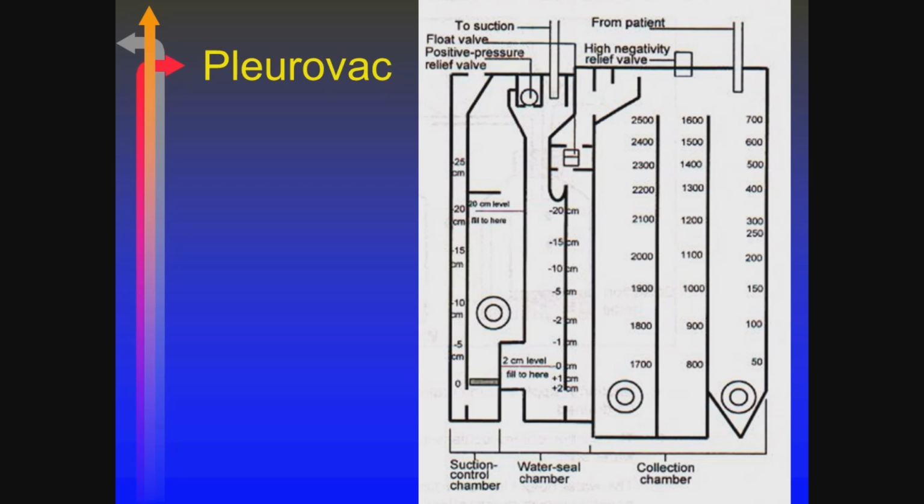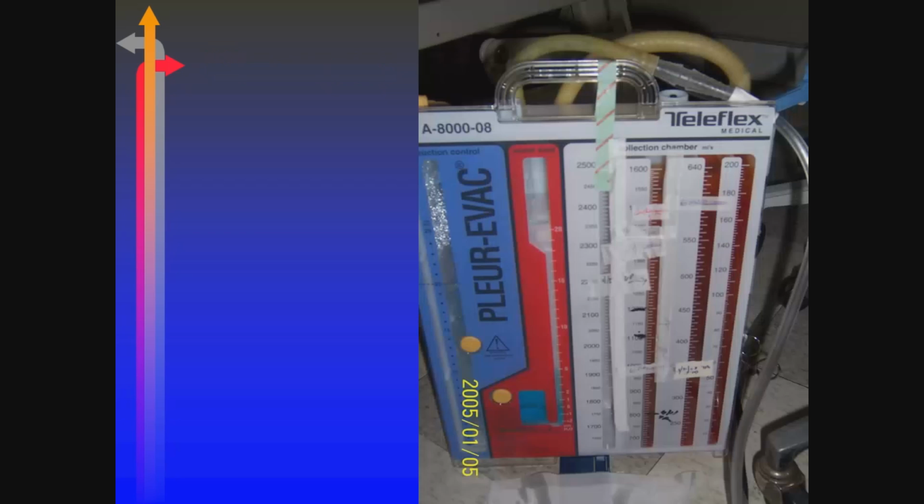And you can see that as this right-hand chamber fills up, it spills over into the second, and then it spills over into the third. Hopefully you never get to a spot where you're draining 2,500 milliliters of fluid off because something's wrong with the system, that much fluid or that much blood being pulled off. And there you have one that's full. Not a real pretty sight.